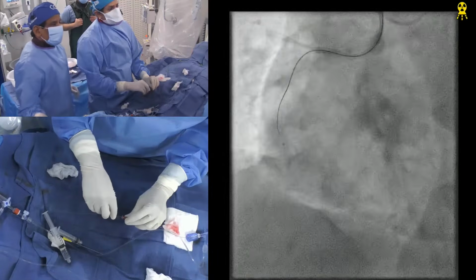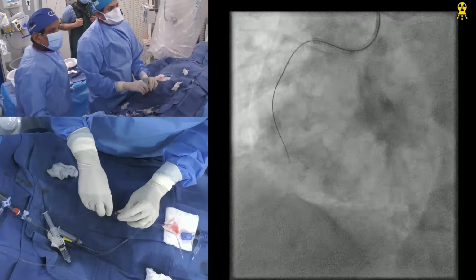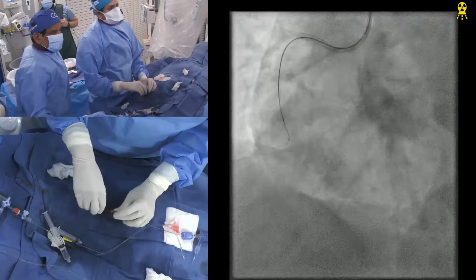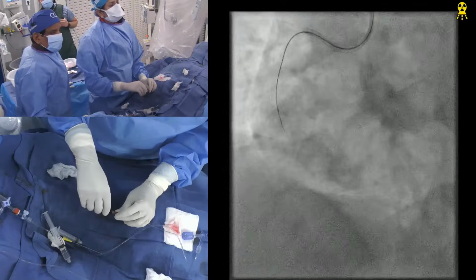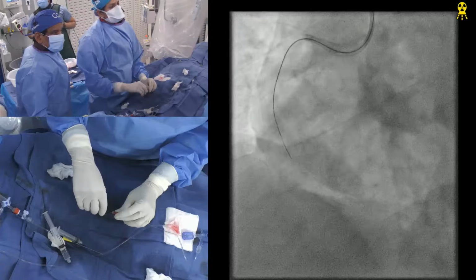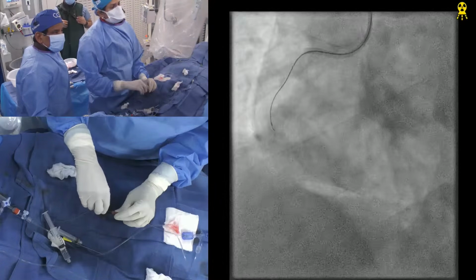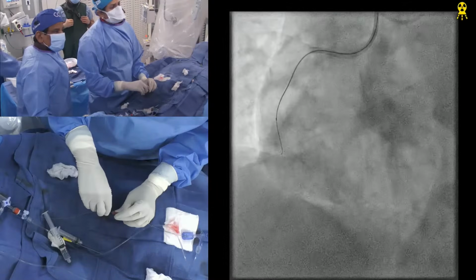this is taking us back and back into the same area. The other thing is, get me the Hornet before I change. That's it, the last. Here I need to get in right here. You don't think it's even higher than that?